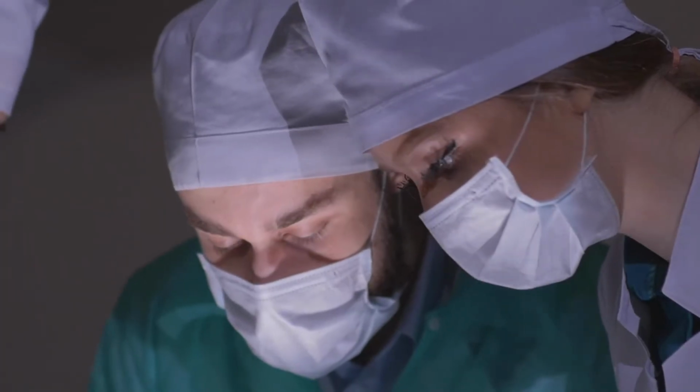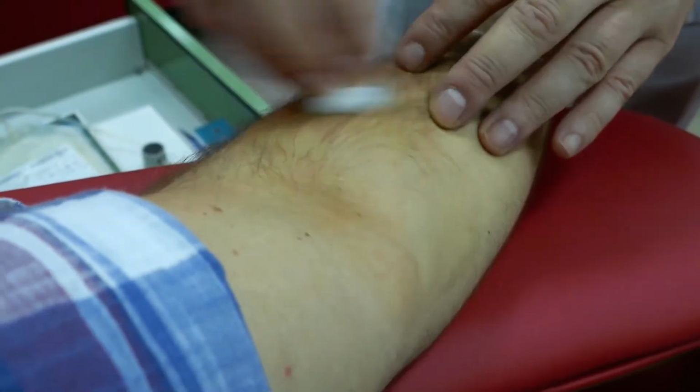Some weeks before, your doctor will prepare an access site on your body in order to do an arteriovenous graft or an arteriovenous fistula. What happens first? The doctor will use anesthesia to numb the area. In the case of an arteriovenous graft, a small incision will be made in the forearm in order to access the artery and connect it to the vein. And this is done using a small plastic tube. However, for the arteriovenous fistula, a small incision is made in the skin to connect the artery to the vein. Only when this vascular access point is healed can the dialysis begin.